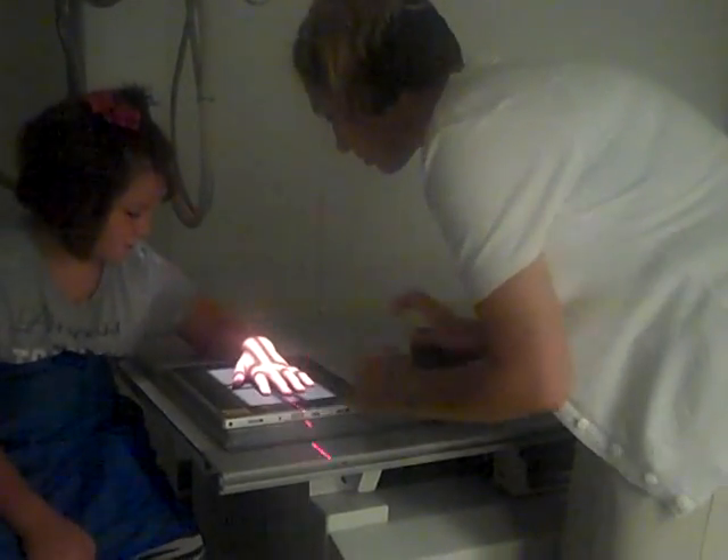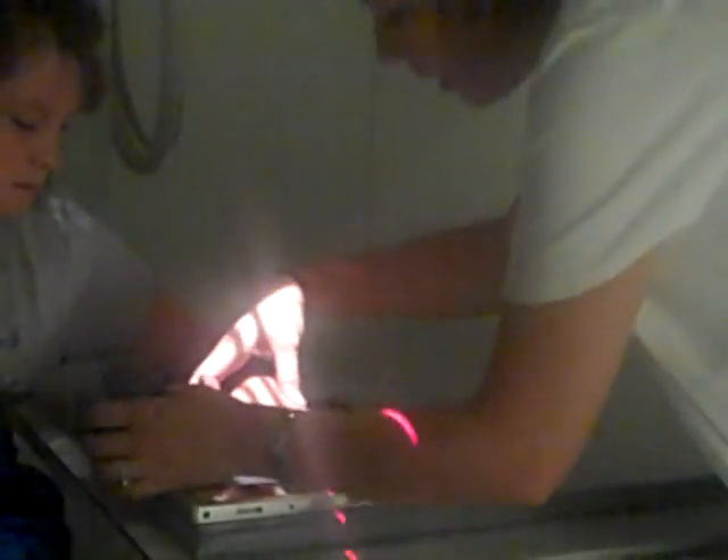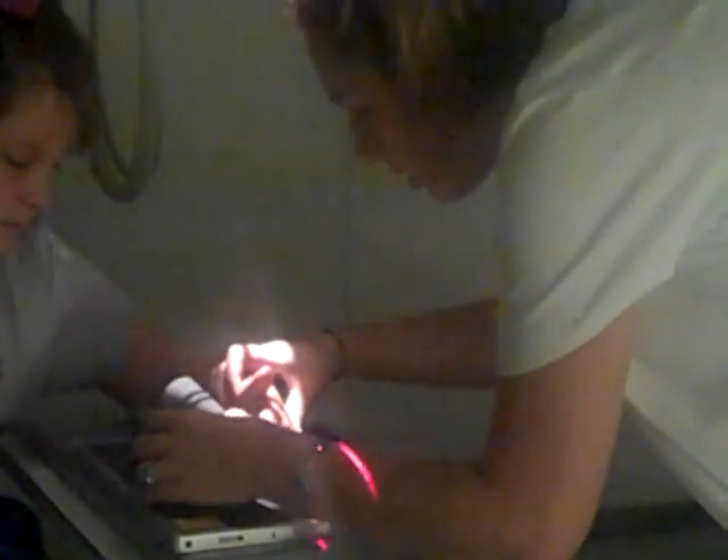And again, right down in the middle — that looks very nice. I use a step sponge to rotate the hand up to 45 degrees. Then have the patient rest their fingers right on the stairs. You want to make sure that you spread those fingers out so that they don't overlap on the film.